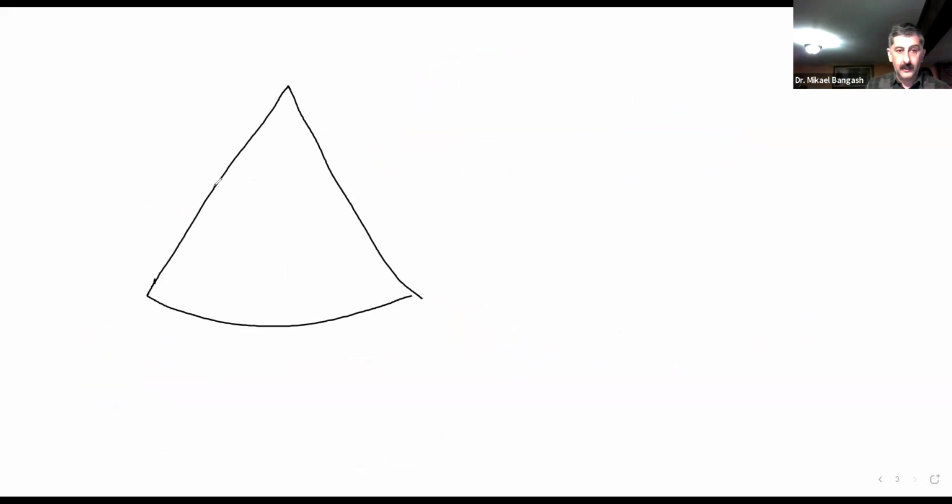And let's say that we see a bright strip here. This is hyperechoic. Clear? Now there's nothing wrong with seeing something like this across your screen.